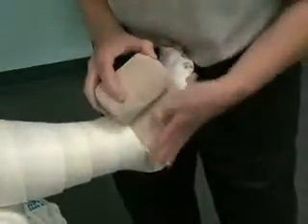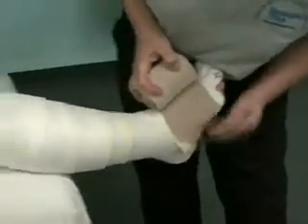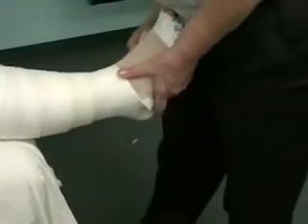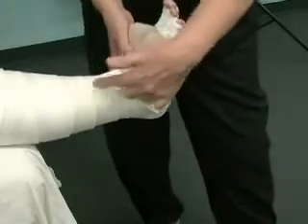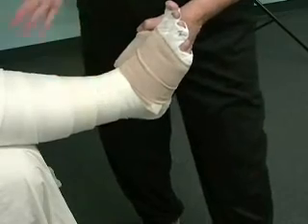Watch. This is a 10 by 10, double length. Renee, why would you choose to use a 10 instead of an 8? Because I can go up higher. I have more base. See, I stopped and it kind of stops like right here. And I really don't like that.